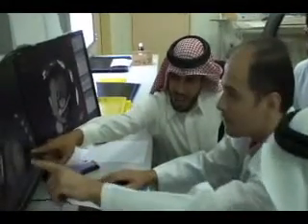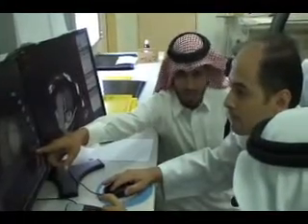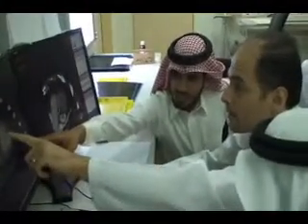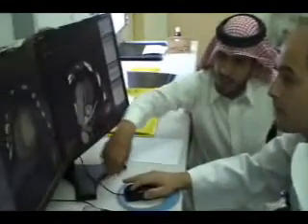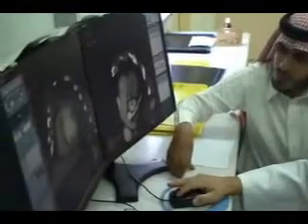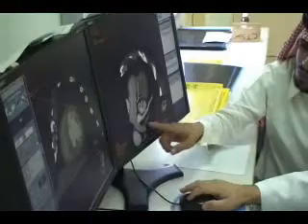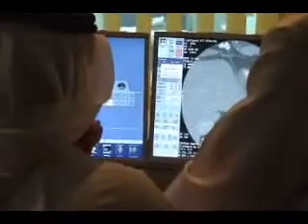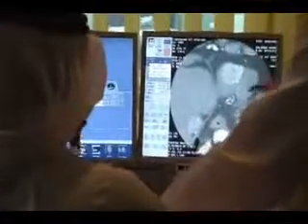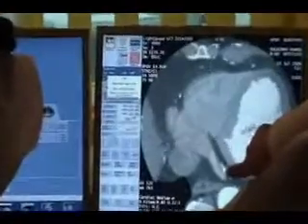The future of multi-slice CT technology holds great promise for non-invasive diagnosis of heart disease. The introduction of 64-slice scanners has greatly improved spatial resolution. It holds the promise of reaping the benefits of diagnosing heart disease without invasive conventional coronary angiography. This tool is likely to develop further as a complementary tool rather than a replacement to conventional angiography, especially in patients where heart disease needs to be ruled out.